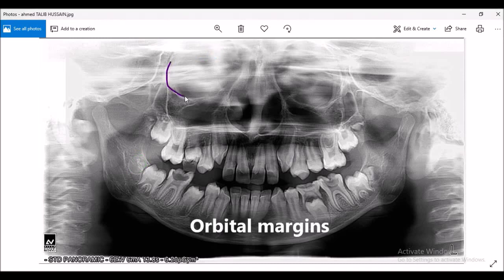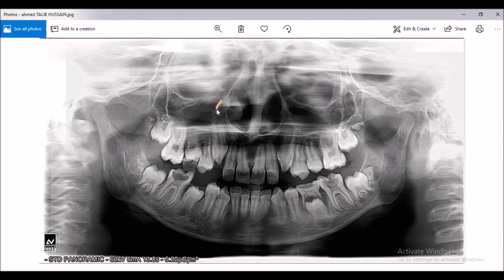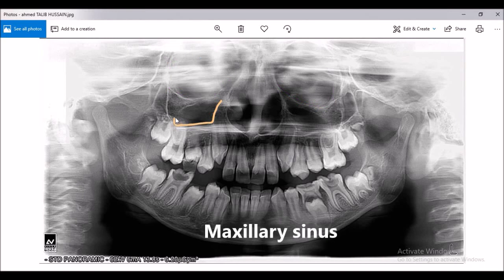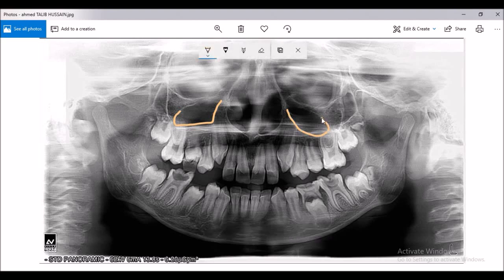These are the orbital margins — this is the orbital margin of the right side, and this is the orbital margin of the left side. This area is the maxillary sinus on the right side, and this space is the maxillary sinus on the left side.